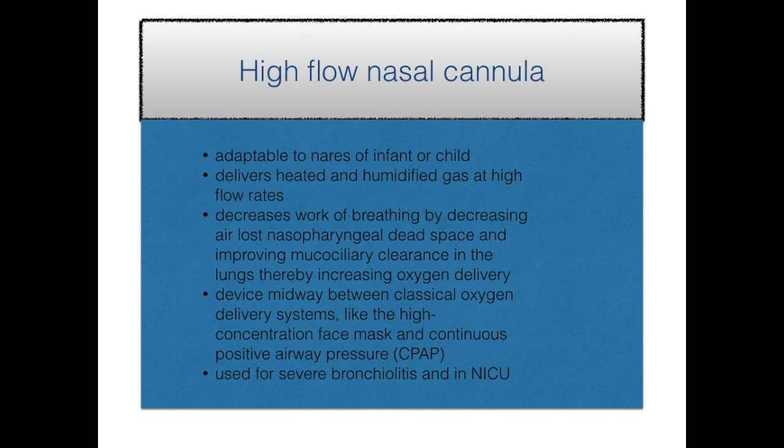We have something that's being used more and more frequently for our children who are admitted for severe bronchiolitis, and you will see it used in the NICU, and this is a high-flow nasal cannula. The benefit of this is we can adapt the device to the nares of the infant or child, but it delivers a heated and humidified gas at a higher rate of flow.